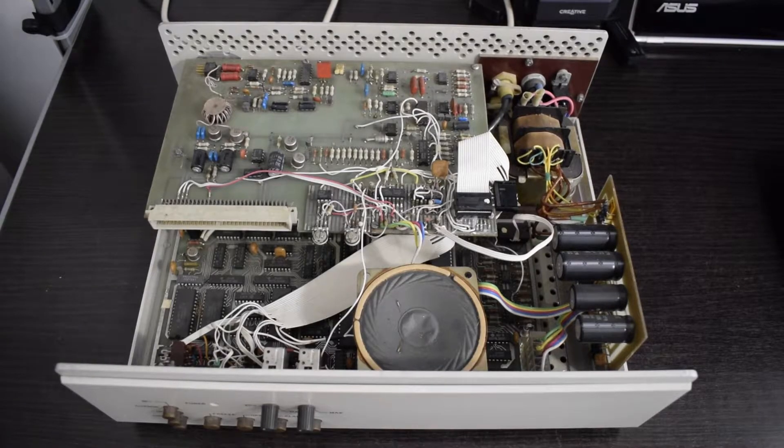The power supply looks great and it's well isolated — you should not power surge your patients with high voltages. Those 32-year-old Bulgarian electrolytic capacitors are made according to the Bulgarian national standard, still looking great — none of that capacitor plague infested rubbish.